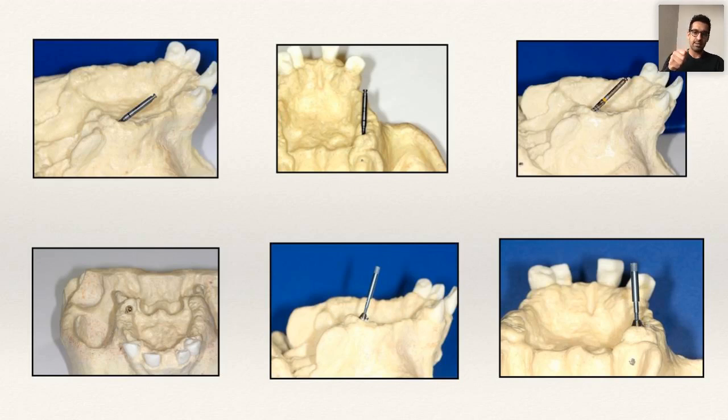The lance bur sinks in, then it's hard, then I'll put my foot on the pedal and it sinks in and I draw back. What you don't want to do is just keep going. Really dangerous. The lance bur is usually thin, and what you do not want to do is potentially risk breaking that, because you're not getting that out. Or if you keep going, all you're going to do is traumatize the muscle. It's not unusual to get a bit of a bleed, because remember, we've got the pterygoid muscles back there, they're highly vascular, and you often get some bleeding, really quite a bit of bleeding, more than doing an osteotomy elsewhere.